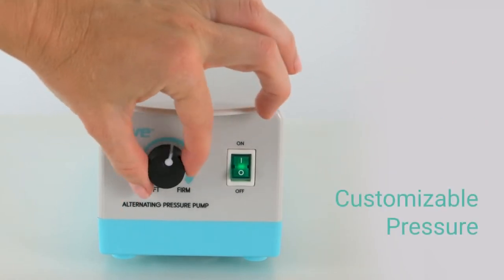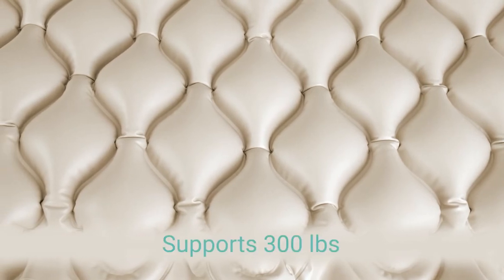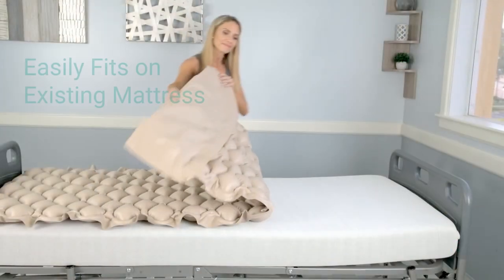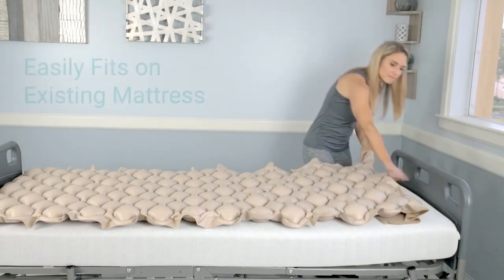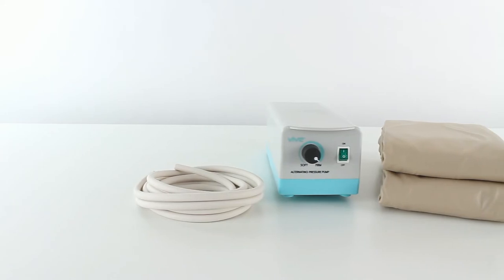Multiple levels of customizable pressure are available. Premium waterproof vinyl supports up to 300 pounds and is heat sealed to ensure durability. It easily fits on existing mattresses, and the included air hoses are flexible for easy installation.